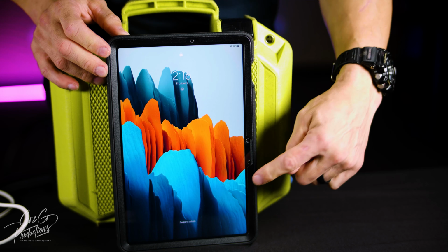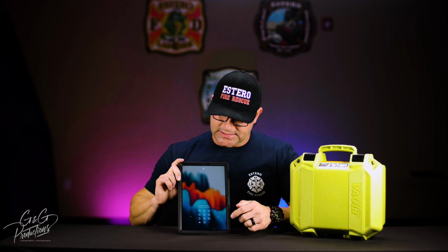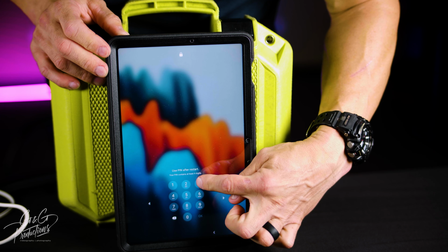So the first thing we're going to do is go over basic functions, like just how to turn the unit on. You're looking at the tablet and you're oriented in an up-down position. The first thing you do is press and hold the on button at the top right for some time, and it goes through its functions, warming up in the mornings. If it's been turned on already, it'll go directly to that screen, and you let it go through its warm-up. Once the unit turns on, you'll get to this screen here. You're going to swipe up and you're going to see that there's a 10-digit keypad here. And the number for that is 3473.